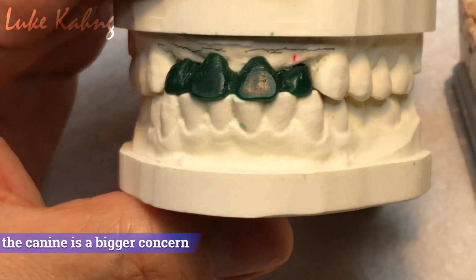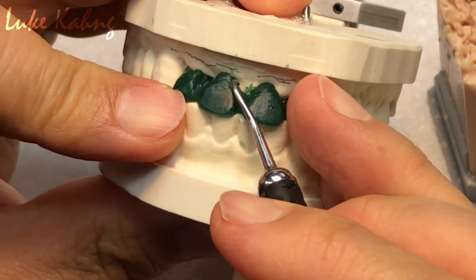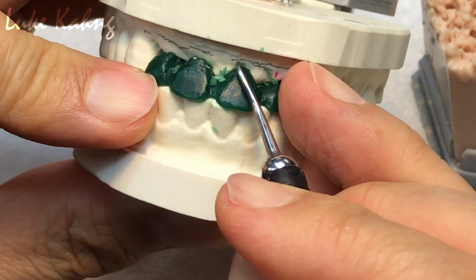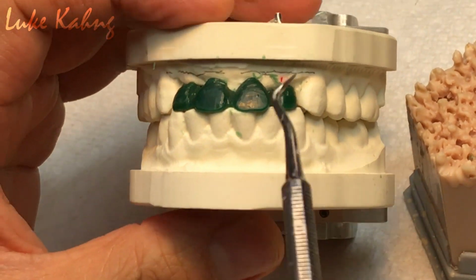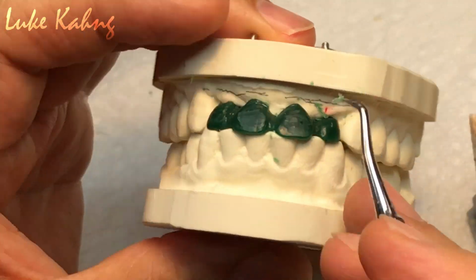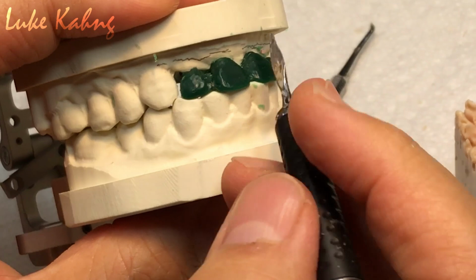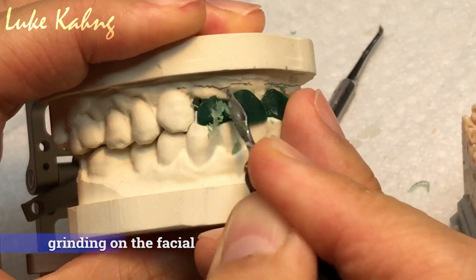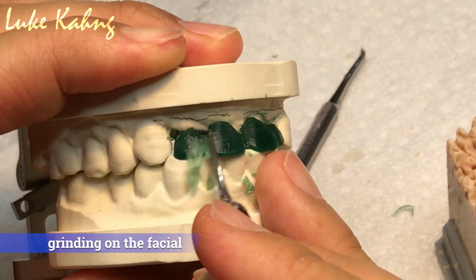Draw it, so we see, then I cut it. Right, that one is my final tissue contour. Make sense? And then second, I noticed this is too fat. So where did you grind? Here, the side, like I said, like I did. You grind this much. I'm not talking about here. Okay, I'm talking about this.